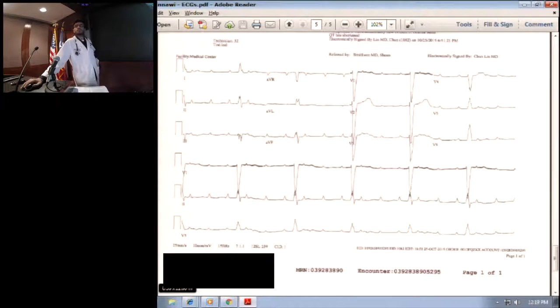What I've been pointing out is that you're not seeing a typical sinus P wave and then it goes to block because you messed with the right bundle and caused a block. Most likely you have a supraventricular, like atrial, tachycardia, and it's fast, that causes a tachycardia-dependent paroxysmal AV block. I think that's the mechanism. Why? Because the P wave is upright in V2.